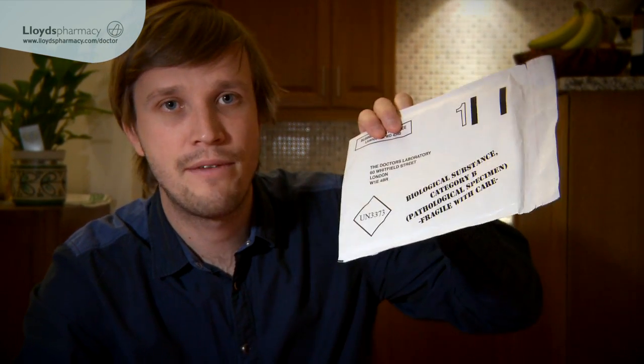Of course you've got an instruction manual. Inside here it will tell you exactly how to do the blood test. And then last of all you've got your request form and your prepaid envelope so you can return your blood test to the lab.